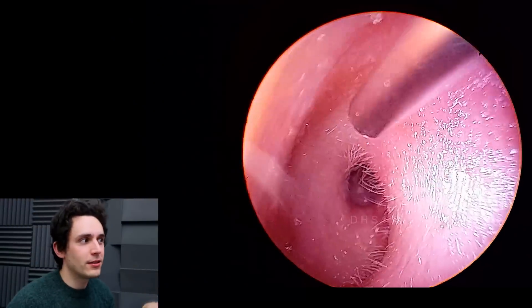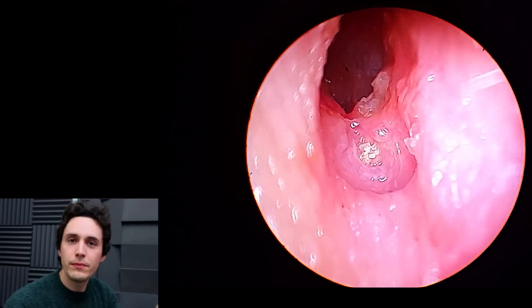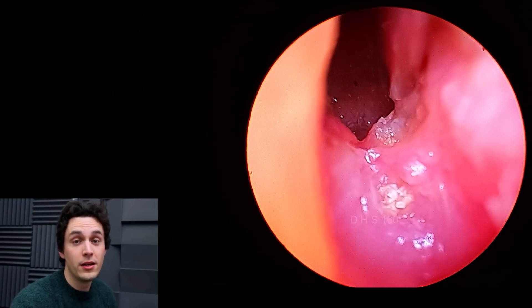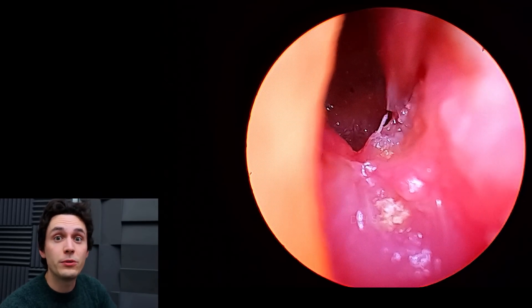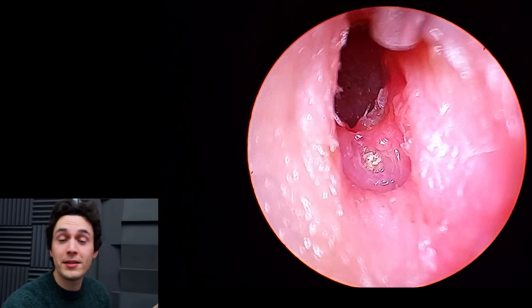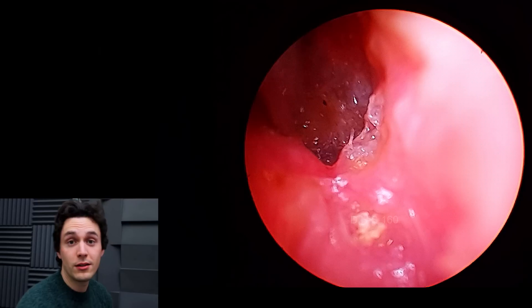What I was doing there was looking inside that first pocket to make sure I haven't missed anything. You would be very surprised at how deceptive these can be — the trench or depression can look clean, but if you dig your Zoellner in, you'll find huge amounts of material, slough, and muck that suctions up from what is quite a deep trench. Something I've missed before, but an ENT picked up on, is I found the canal cholesteatoma but there was granulation hiding all over the shop in the trench. So now I'm doubly careful to look with the 30-degree and clear out as necessary.